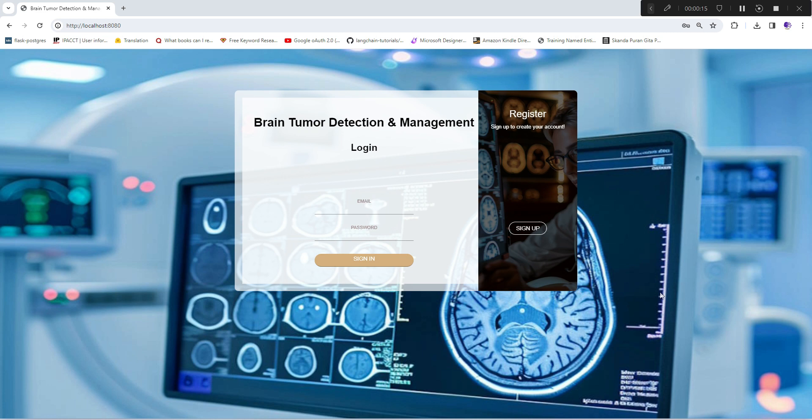In that series, I showed you complete model development including dataset, data preprocessing, and every step. If you haven't seen it, quickly visit and see how you can build a brain tumor detection model.